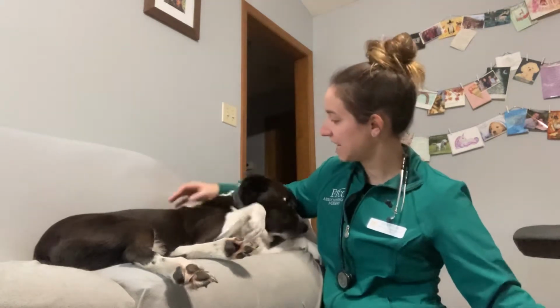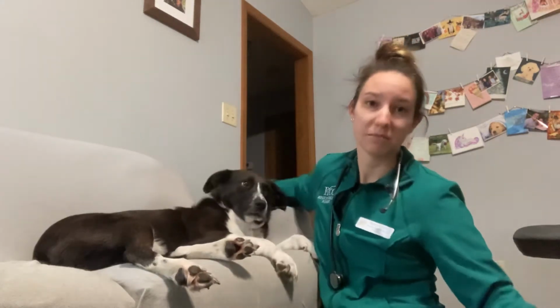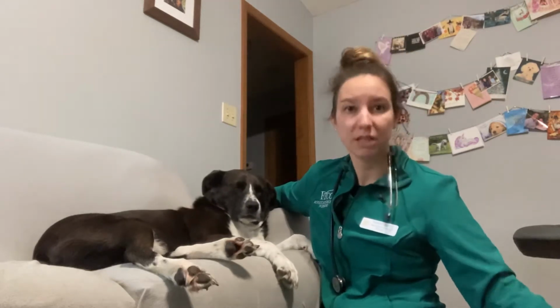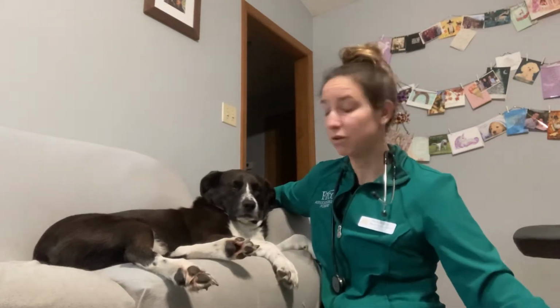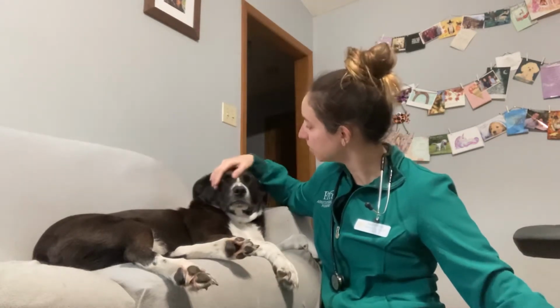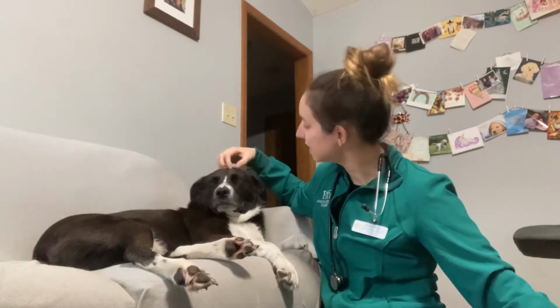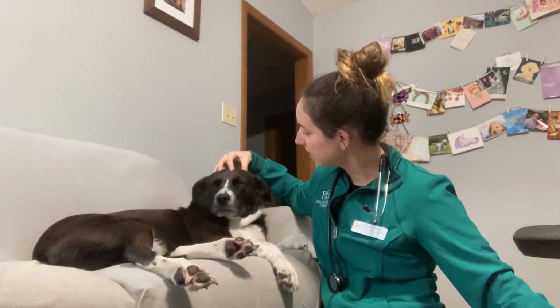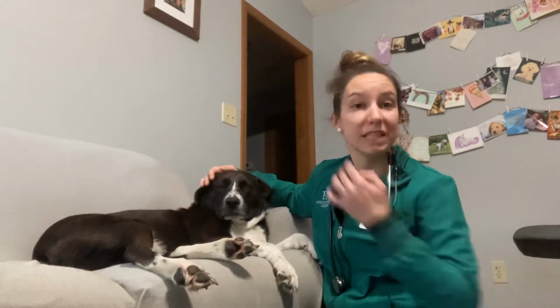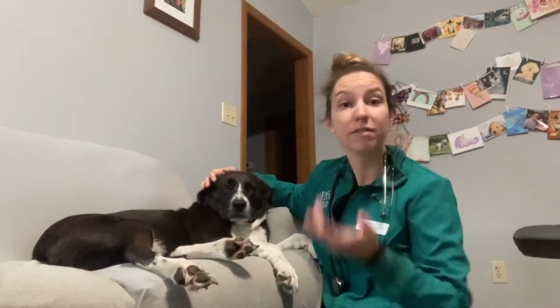So this is Sadie. Obviously, we have to make some considerations because Sadie here is not human. If we were dealing with a human, I would introduce myself first. Hello, Sadie. My name is Natalie. I am a nursing student. I am here to take your vital signs today. Is that okay? Yes. We're gonna go with yes, that's okay. So obviously obtain consent and then verify my patient.